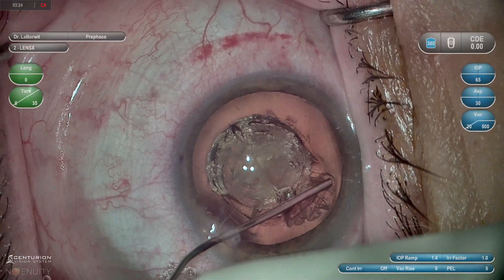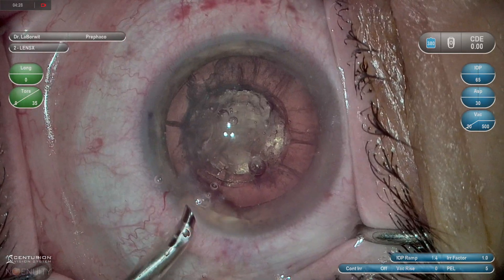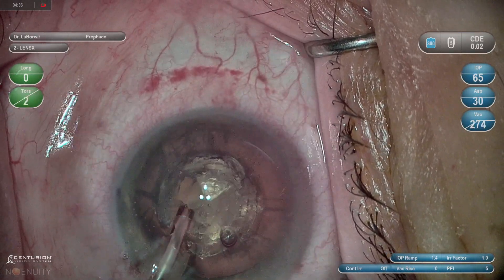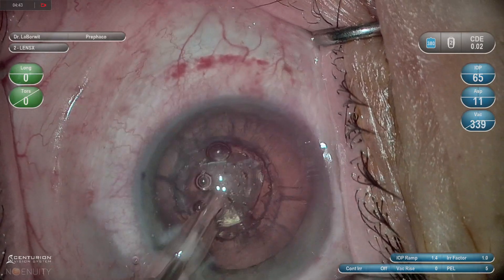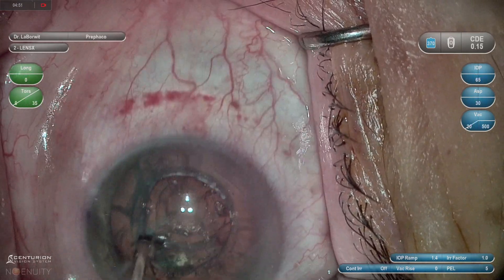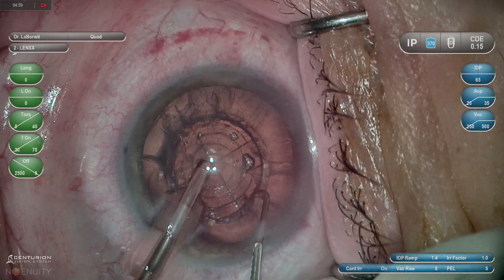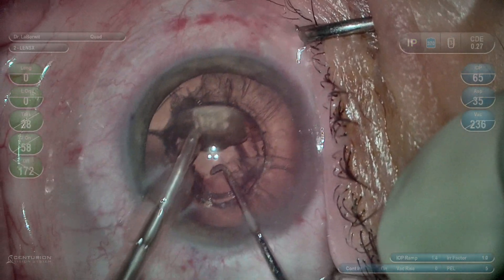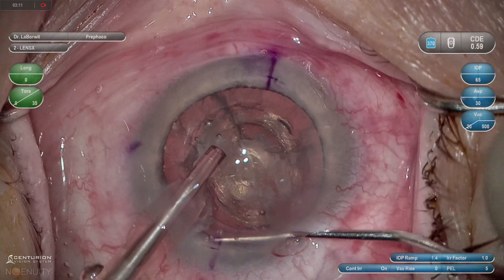This is another case showing the visco-dissection. You can see how pieces of the nuclear core area easily come up because of the horizontal cut. So I'm using the phaco tip more to just manually push these pieces to collapse them and then remove them. I can tell when I'm at the horizontal cut because of the bubbles on the surface, and I also know that at the 50% mark I can place my second instrument to remove the bottom half.